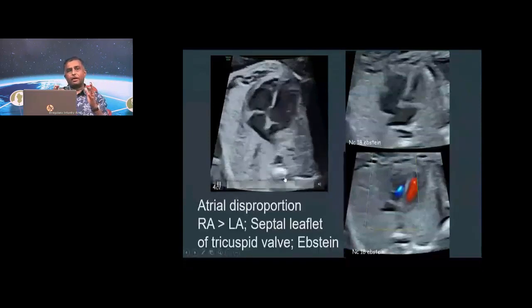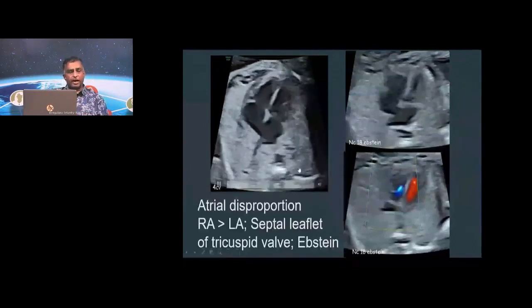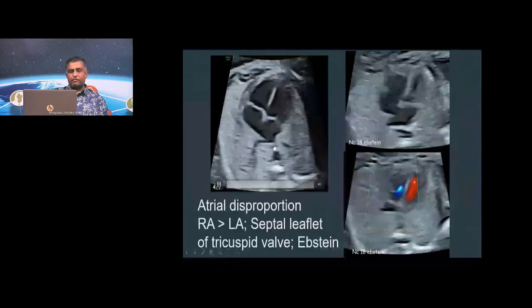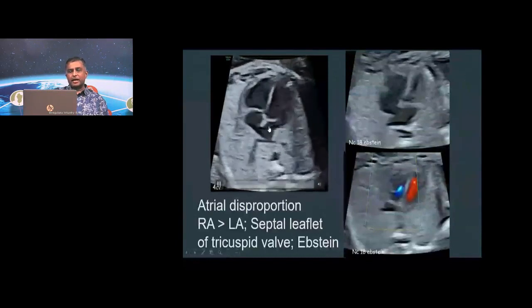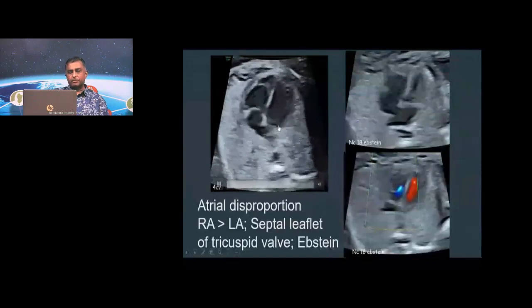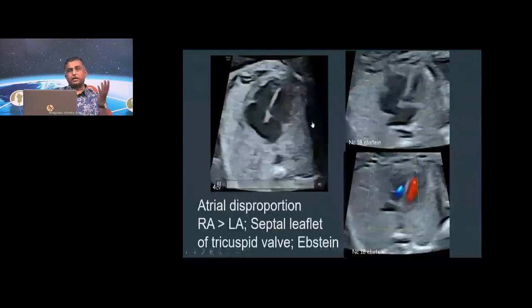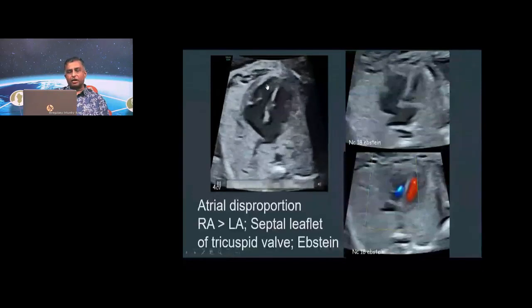When you see a clip in a conference you're attending, or you're looking at this presentation going on now, how are you going to orient yourself? Look at the spine, and that's the descending aorta. Very close to the aorta is the LA, and you have the pulmonary veins opening in over there. This is LA, and this is LV, so therefore this is the mitral valve. This is left side, this is right side. You've already confirmed that in a preliminary step, which we've already gone through. Now, if this is LA and LV, this is RA and RV out there.